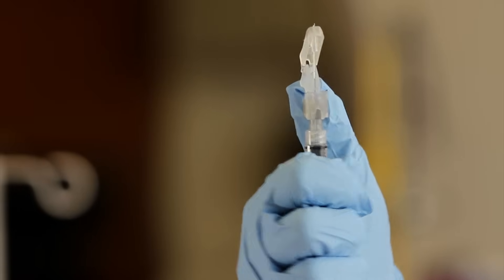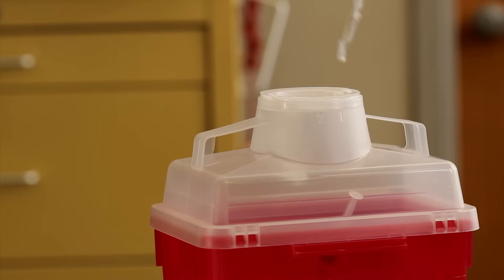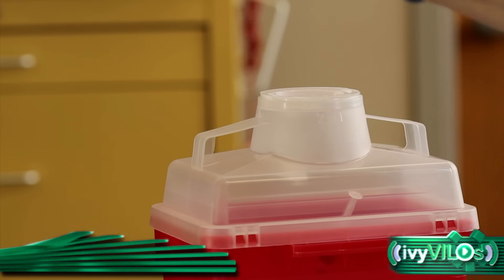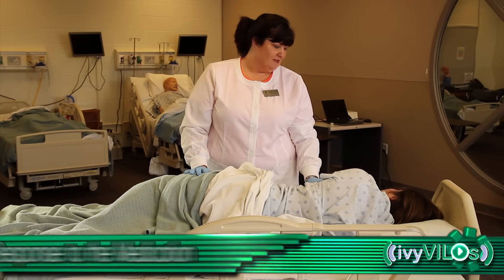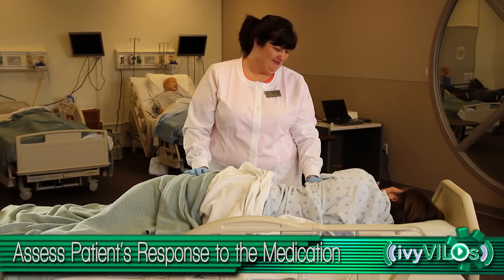Engage the safety shield or needle guard. Discard the needle and syringe into the appropriate receptacle. Assess the patient's response to the medication.